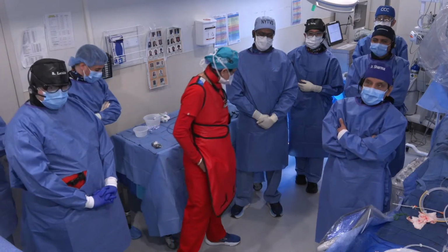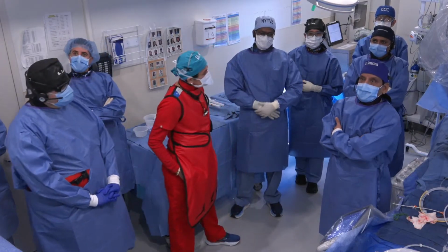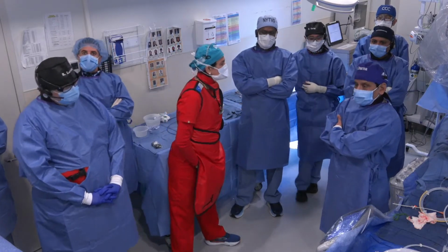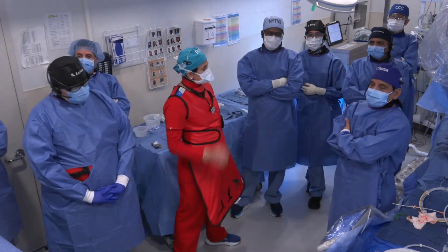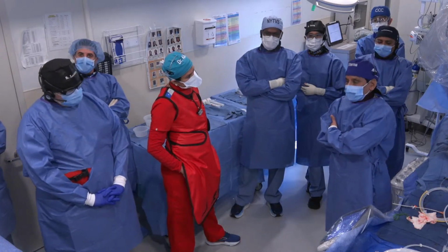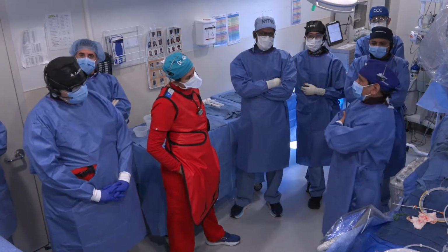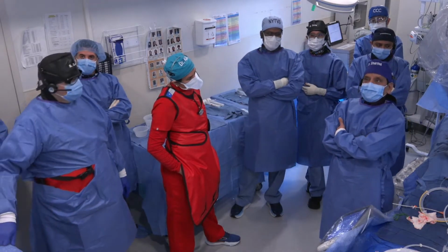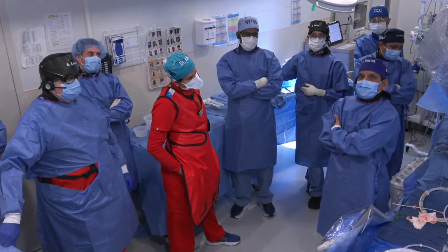But they are planning a bigger cutting balloon now for aortic valvuloplasty, same as the IVL. And even if not, it would not be a bad idea to use a peripheral IVL of 6 or 8 millimeters on the one side where there is a calcific nodule. It's a little crazy question, but very provocative and practical.